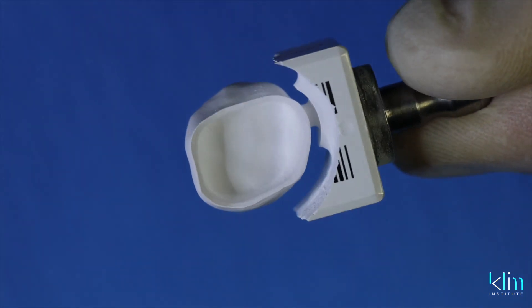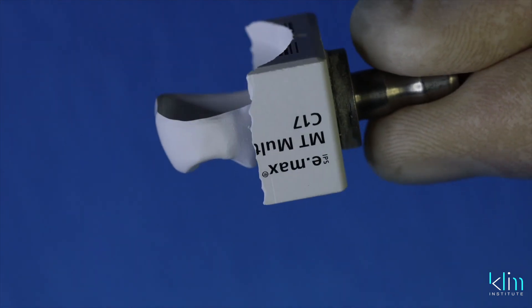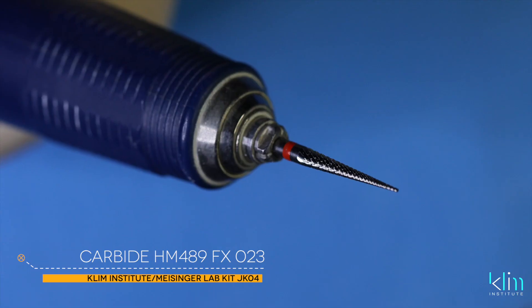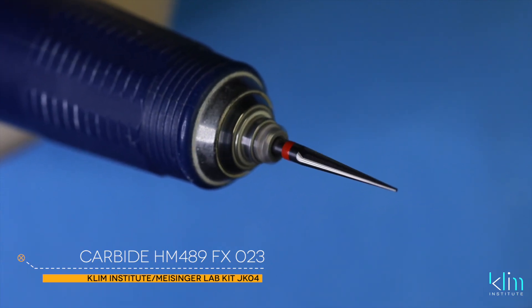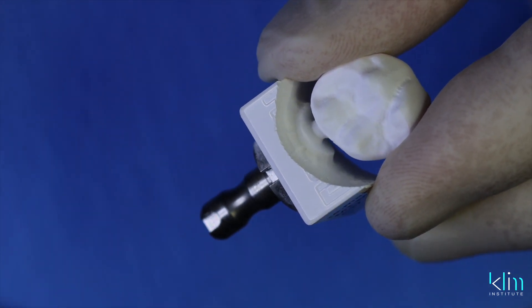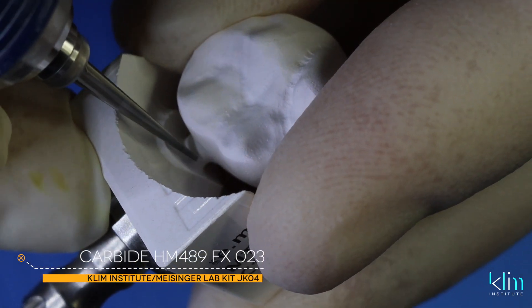First step: separating the sprue from the block. It's really important that we do this carefully. I like using a thin carbide burr. Hold the crown with the occlusal view — it's really important the crown doesn't drop on the lap bench. I've seen that happen several times and it chips the margin.